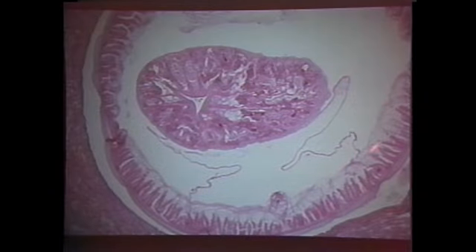This is Dioctophyma, which is another strange nematode. Look at these muscles, how different they are from what we've talked about with our phasmids. Dioctophymas have these kind of membranes, mesenteric kind of strands that go from the muscle cells to the esophagus and intestine. There they are. And they have a very strange esophagus. And look at these muscles. See, they don't have that nice cytoplasmic portion.